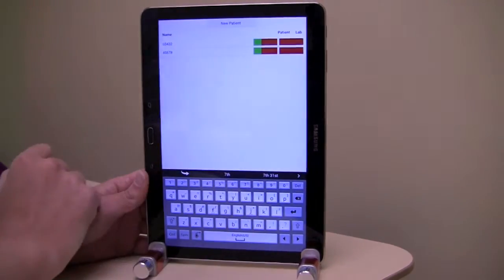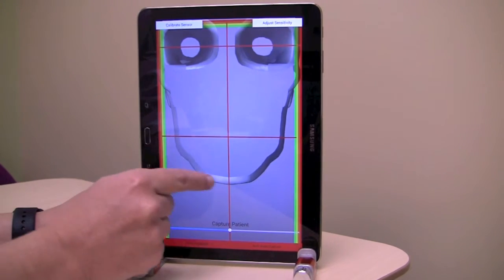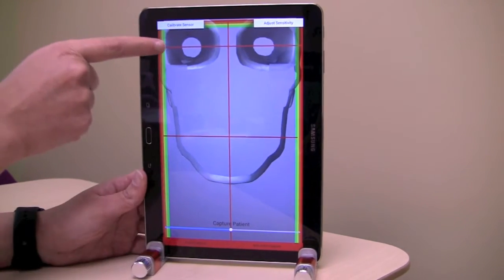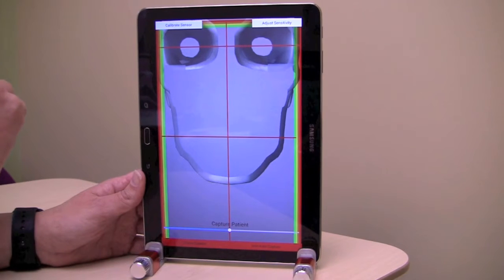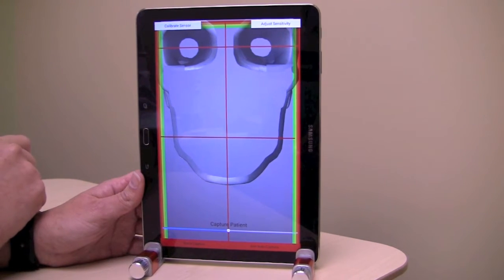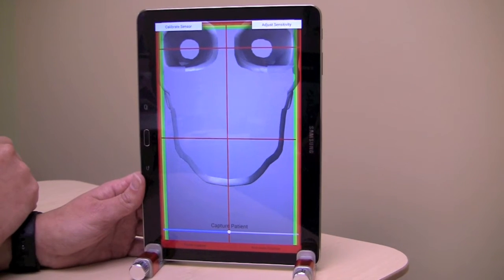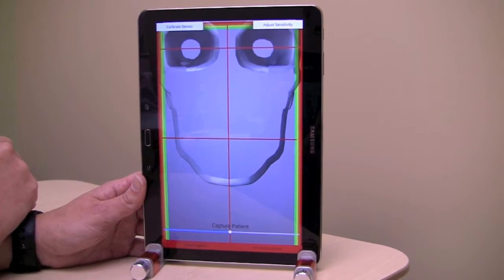We're going to click OK, and immediately you'll notice our outline of the facial skeleton, 2 eye circles to aid in placement, 2 horizontal lines to make sure we're parallel to Vanessa, and in the center we have a vertical line to help Max make sure we can align her to her facial midline.